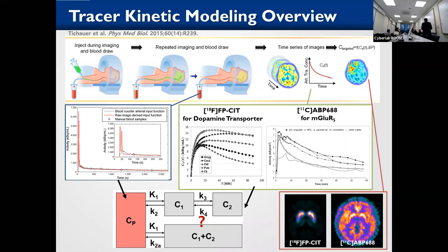But in static studies, if you use a very fast injection for one person and a very slow injection for another, it makes big issues. We usually use the same time window, for example 60 to 90 minutes, for patient 1 and patient 2. But if their injection speed is different, the optimal time point will be different for each person. You see the big issue.